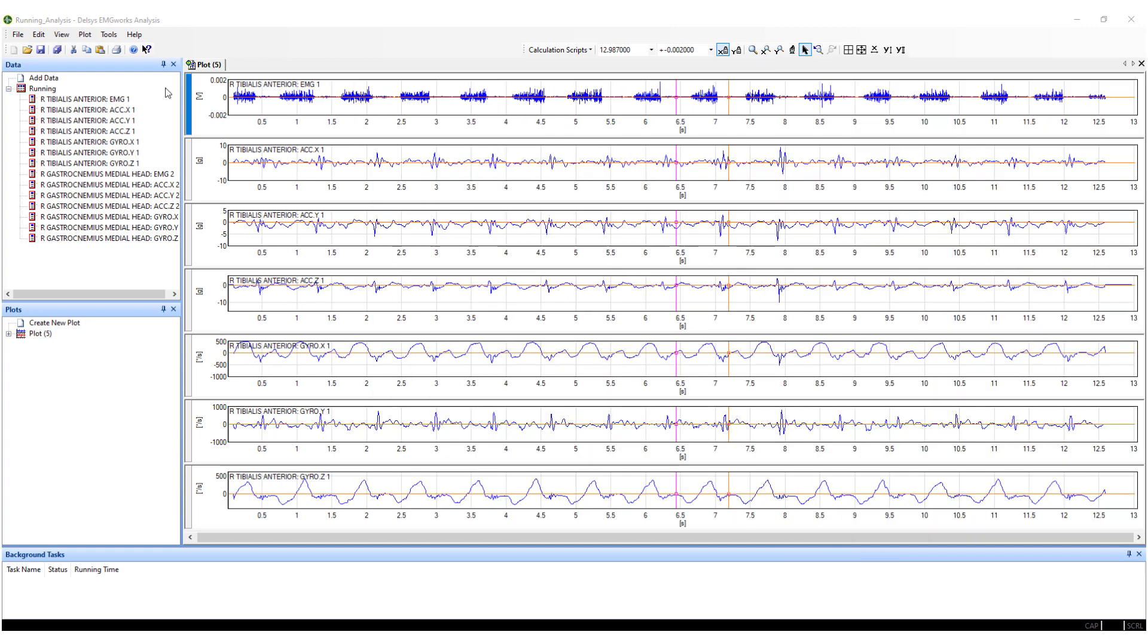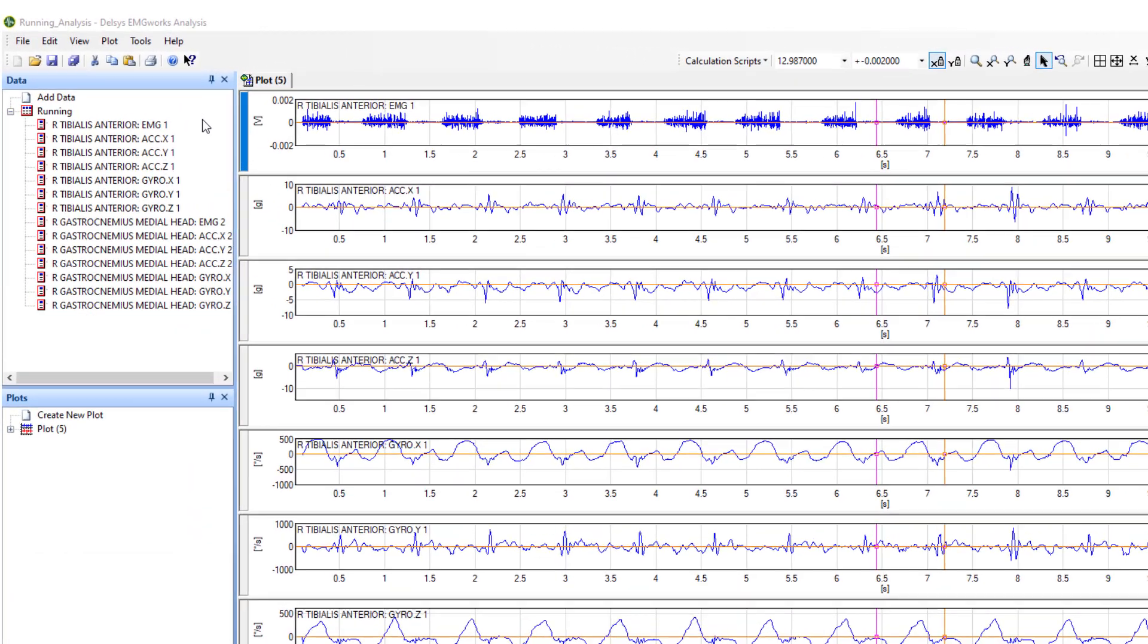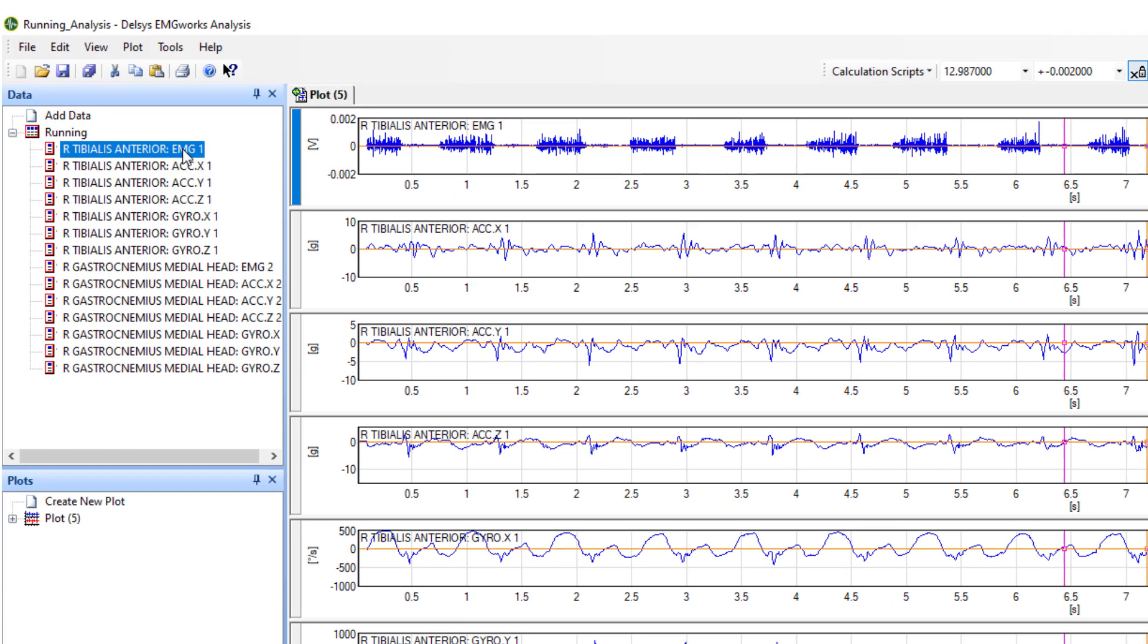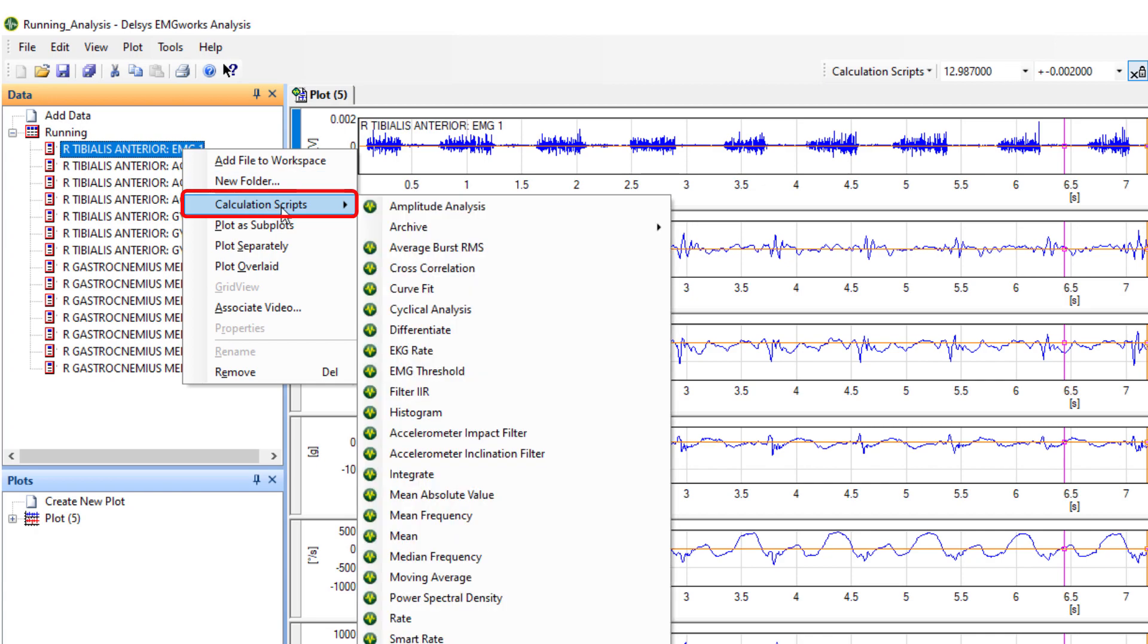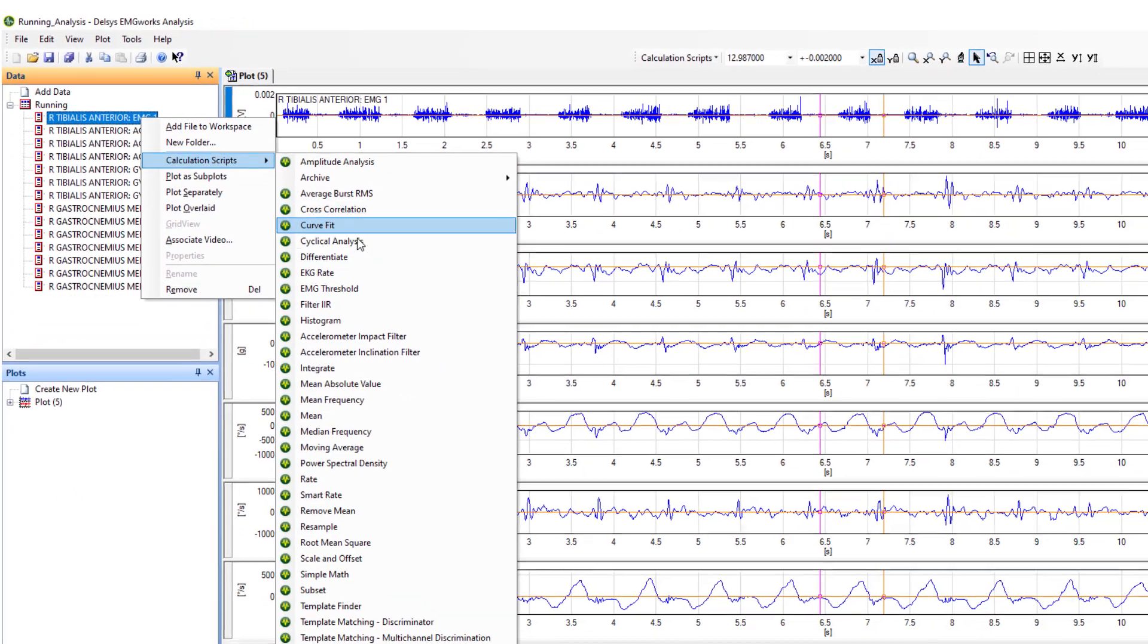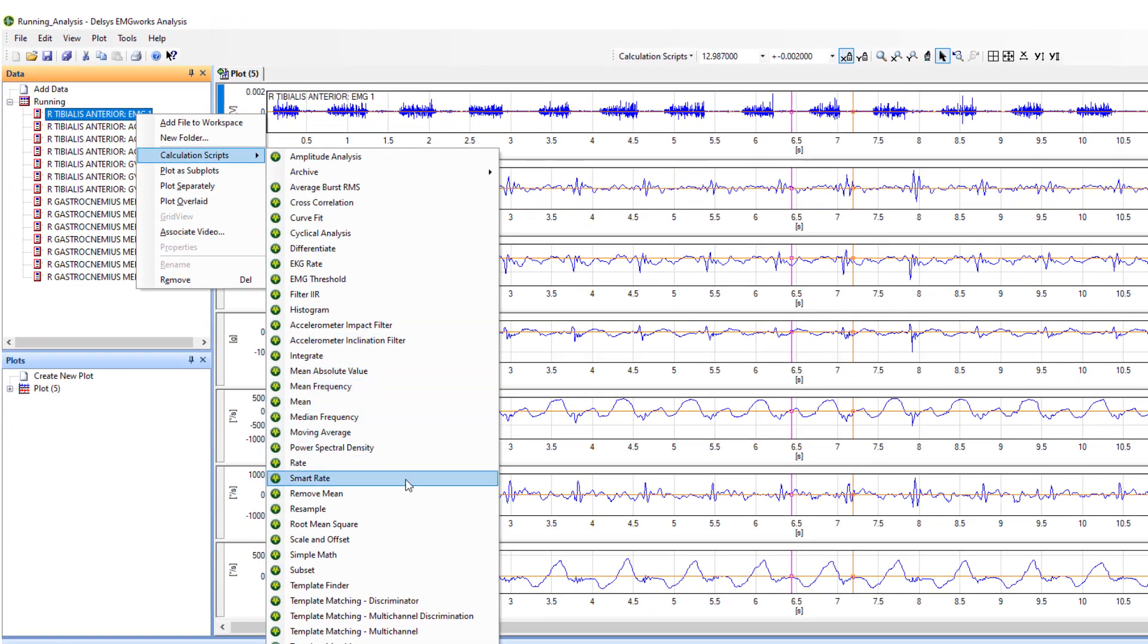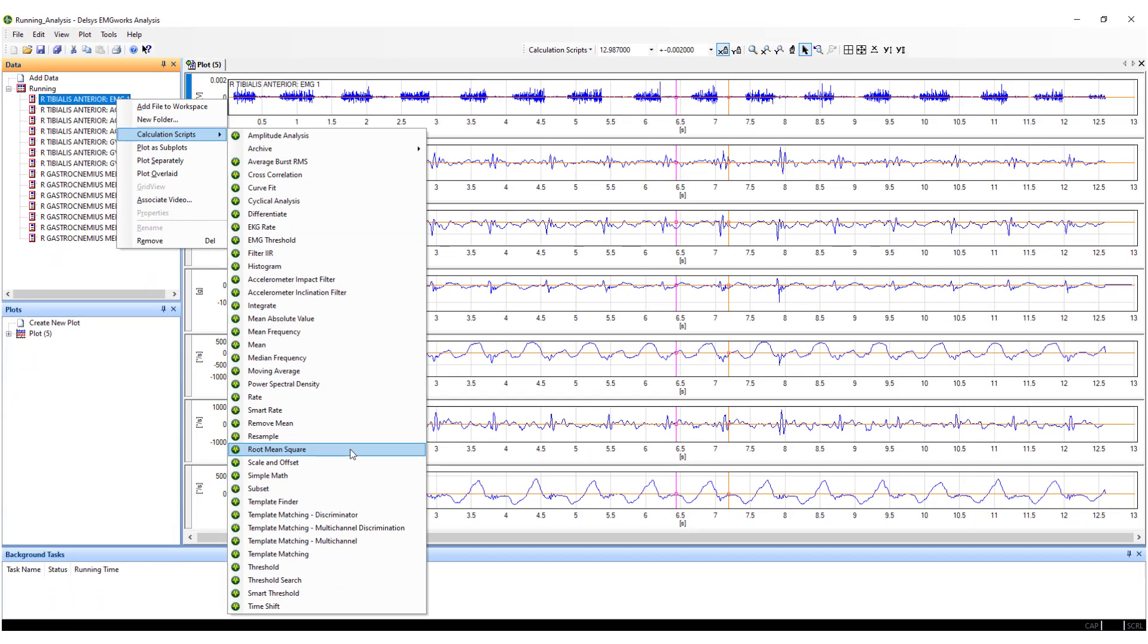EMG Works Analysis comes with many in-built calculation scripts. One of these is on how to perform a Root Mean Square or RMS on your data. To perform an RMS calculation, select a data channel or channels. Right-click and select Calculation Scripts. Select the Root Mean Square option within the Calculations list.